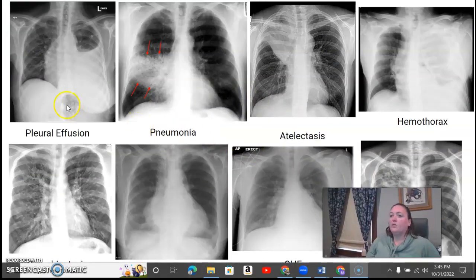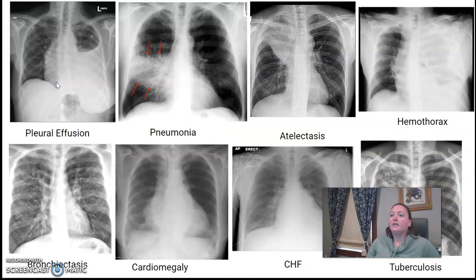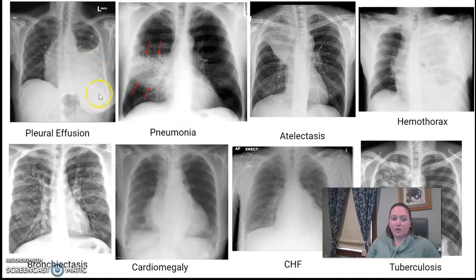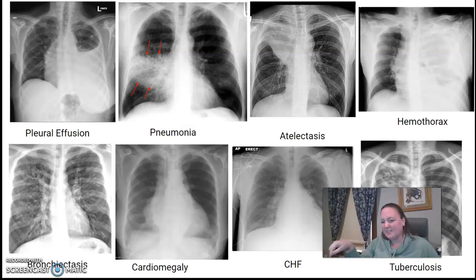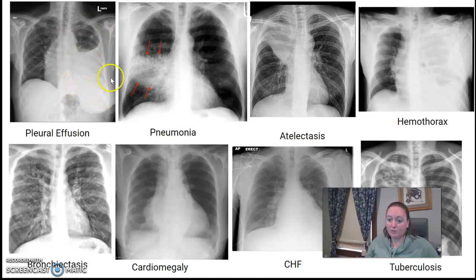Let's go through some images. This first image is your pleural effusion. The lung usually has a rounded appearance — you're not seeing air all the way down to the costophrenic angle, which is your little triangle at the end. And it's white or grayish in color. This is fluid in the pleural space, not fluid in the lung. The pleural cavity surrounds the lung, so it's fluid around it, which makes this area more dense than normal. So this is an additive finding.